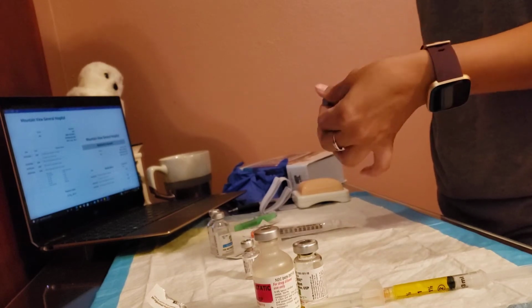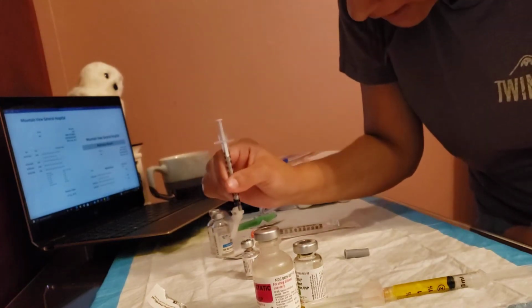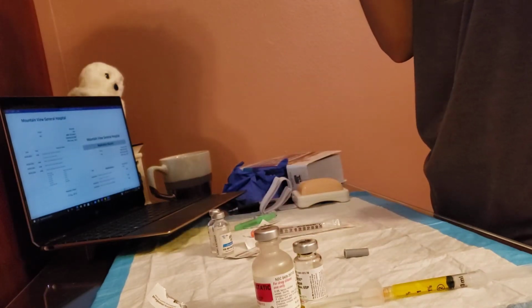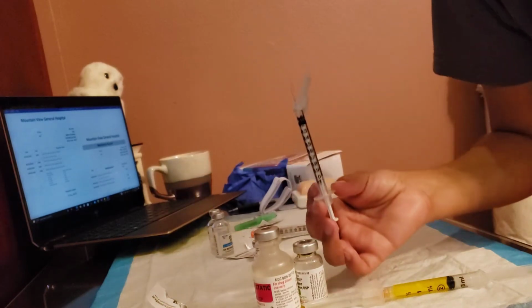So I'm going to pull it off, draw back my 0.1 of air, and stick it in here very carefully. Put the air in and then draw back my 0.1 of that. Right. And there's my 0.1.